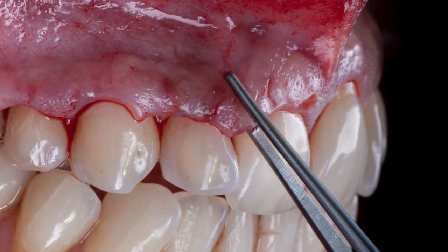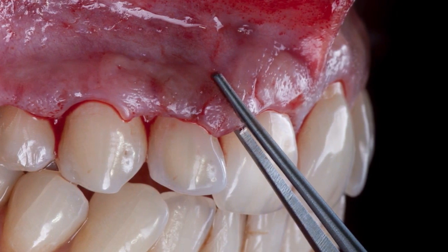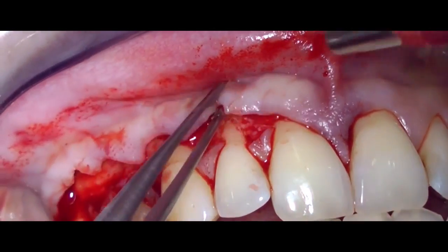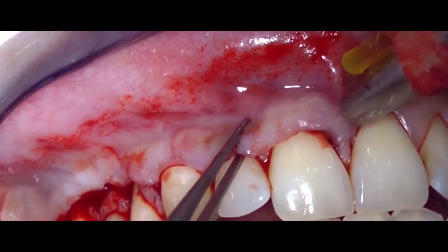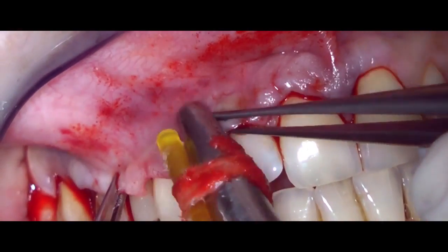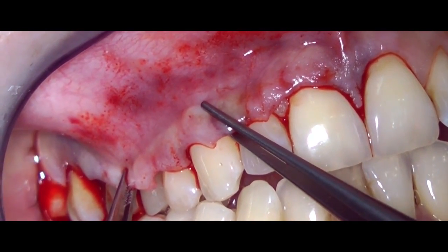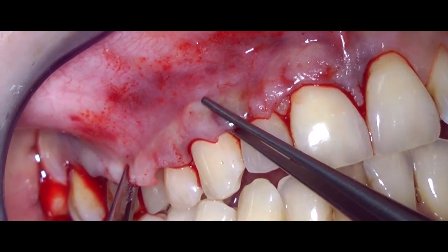We know that the mobilization is complete when the flap can be placed tension-free 1 mm coronally to the teeth's CEJ and the surgical papilla tips can be effortlessly sutured to the anatomical papilla bed.